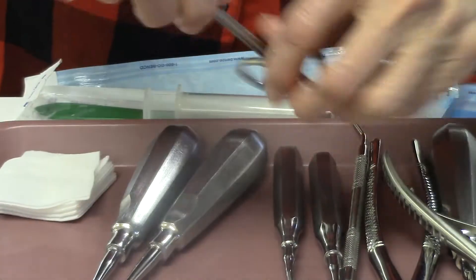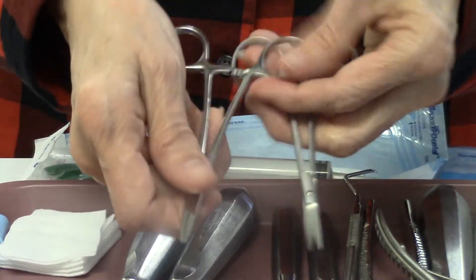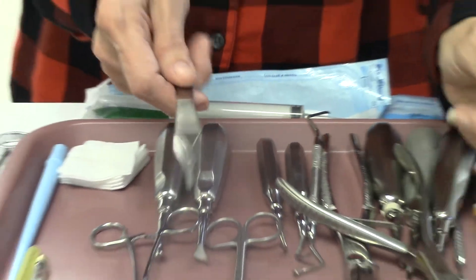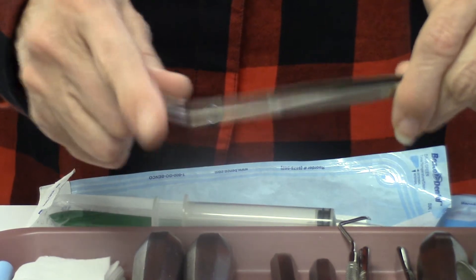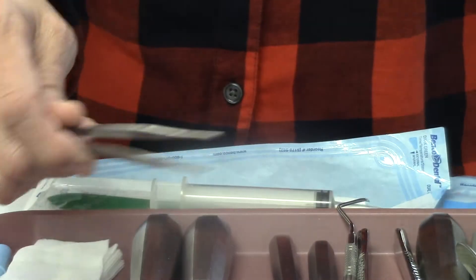We also have surgical scissors and a surgical hemostat. We have our tissue forceps — you can tell how blunt they are on the end, whereas our cotton forceps are much pointier and sharp. That's why these are tissue forceps — so they can actually grasp and remove tissue.